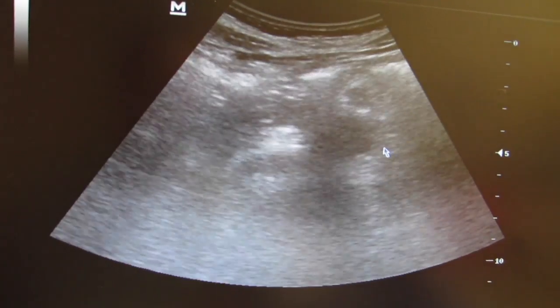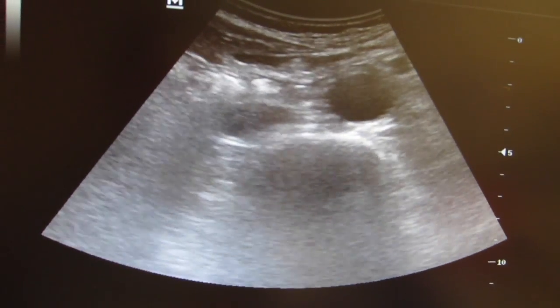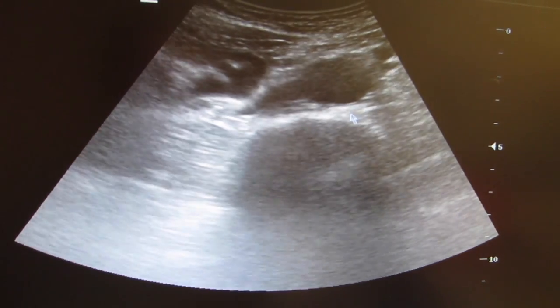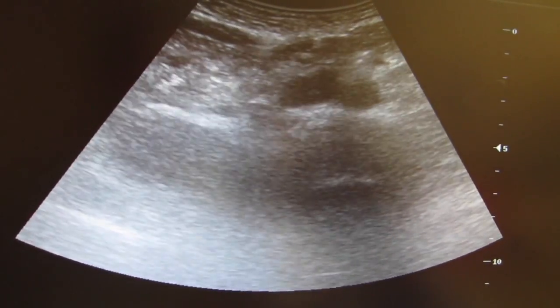Now we're going to track the aorta down farther. As you notice, it will get closer and closer to the surface. If you're going to make your measurements here, you'll want to adjust your depth. And as it comes down, you want to get all the way until it splits.